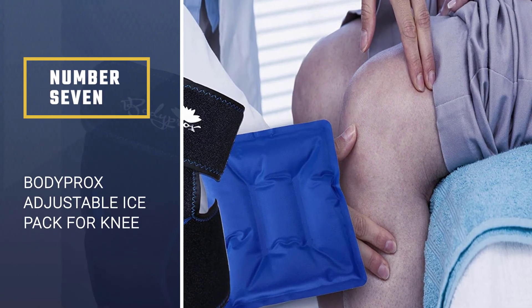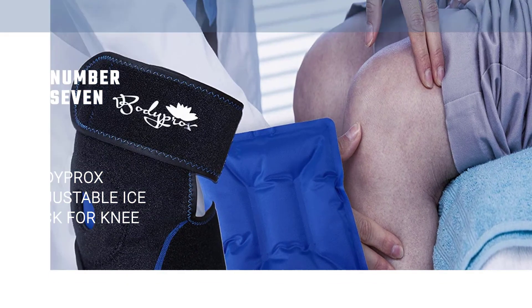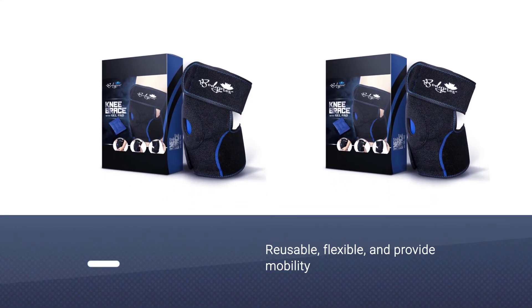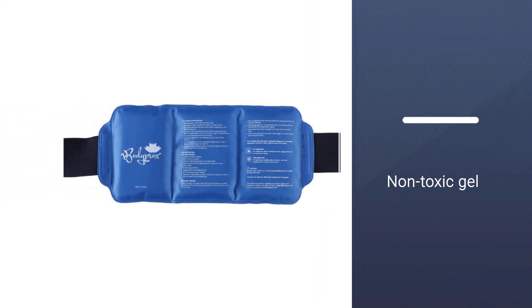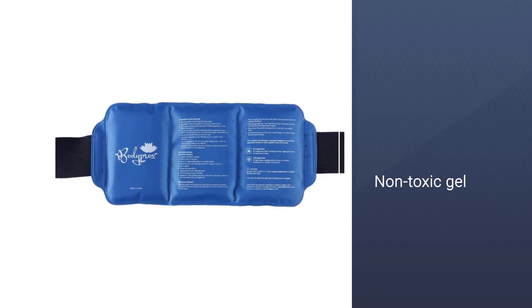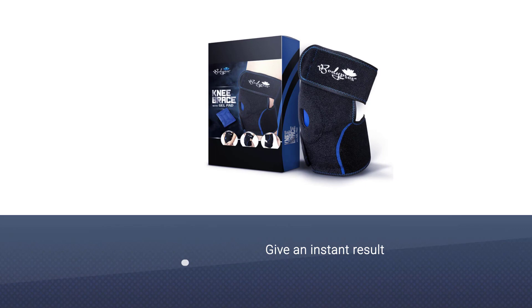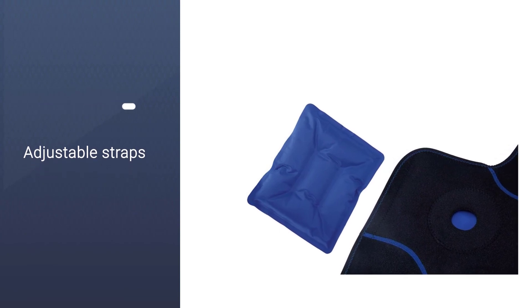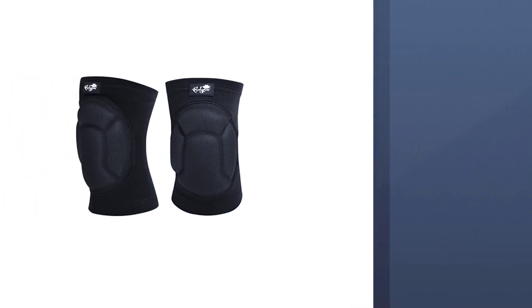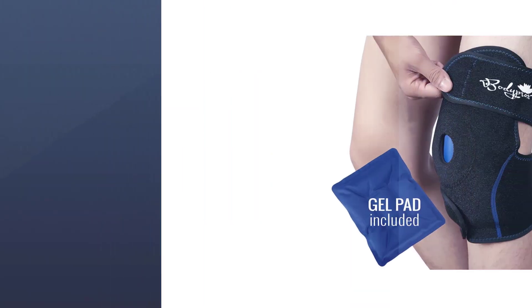Number seven: Body Procs Adjustable Ice Pack for Knee. The ice packs are reusable, flexible, and provide mobility. The non-toxic gel offers better blood circulation while applying ice. The heating and cooling pack gives instant results and doesn't get punctured or leak. Therapists, sports persons, and specialists recommend this cold wrap. Adjustable straps provide comfortable fitting and control compression. It can be used for the elbow, knees, ankle, and wrist, minimizing pain, swelling, aches, and discomfort. Velcro straps enable stability and a better grip on the knees.